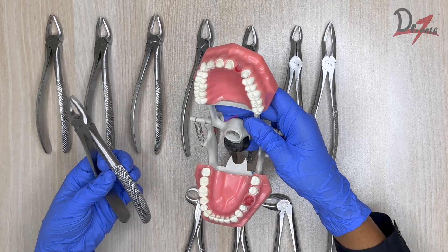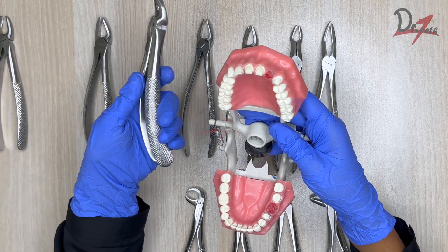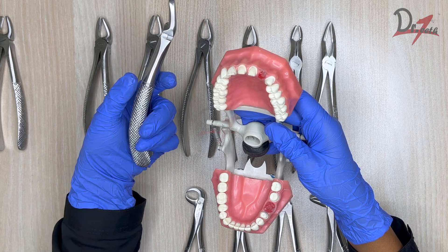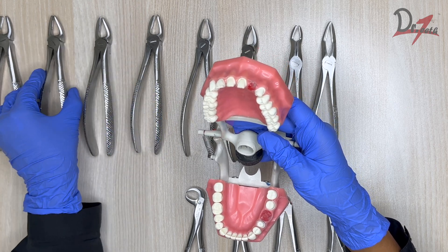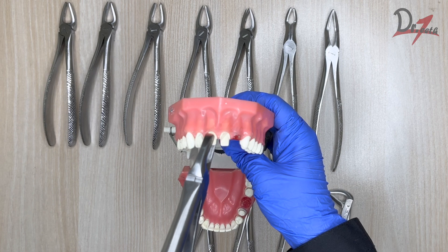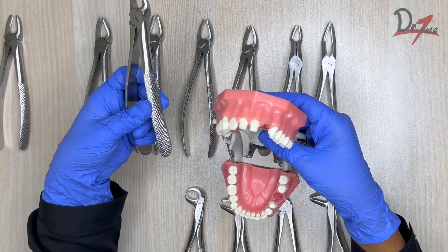Now let's look at how to use the forceps on the typodont. For the grasp — for this flat design you hold it straight, but for designs with angulation, the concavity has to be towards your palm for a better grip. For the maxillary anterior extraction, you grab the tooth, give first an apical pressure, then buccal-lingual movement, then rotate and take out the tooth. For the upper premolar, the same principle applies — apical pressure, buccal-lingual, and take it out.